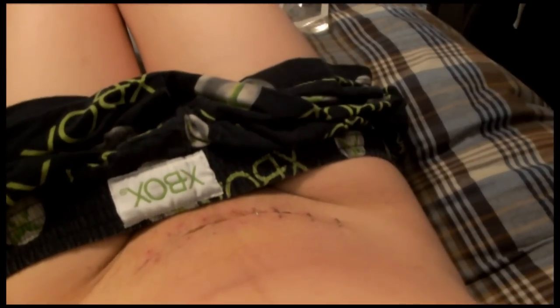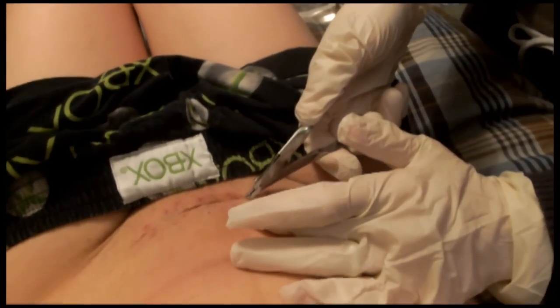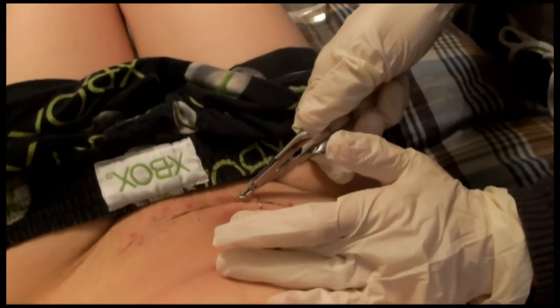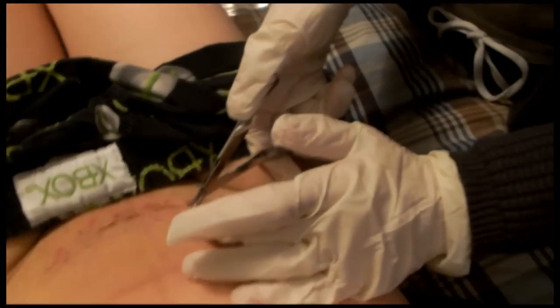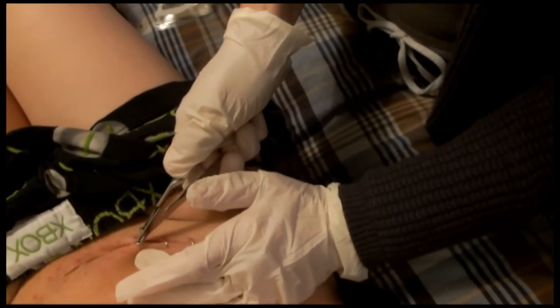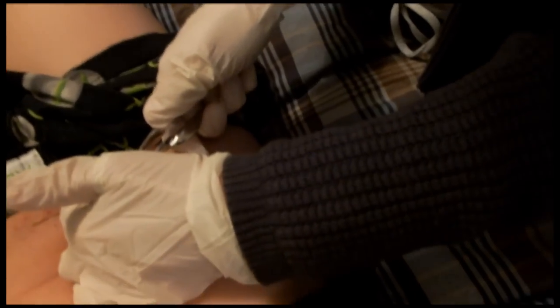Don't hurt. You hurt me. Or I could leave it in for the rest of your life. Do you see how it's being done, Alex? Do you see what they're doing? This one's going to hurt a little bit. Oh my God, oh my God. That one really hurt.